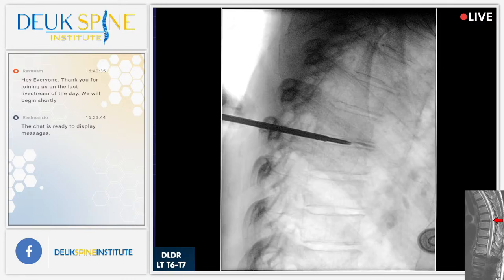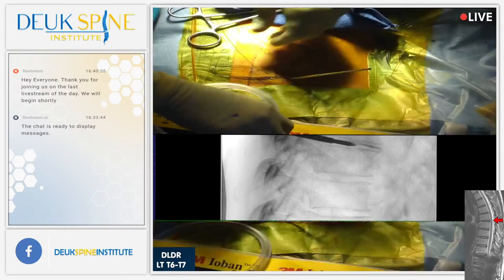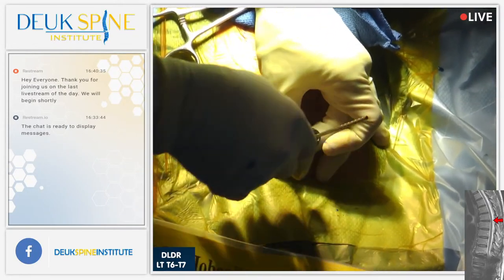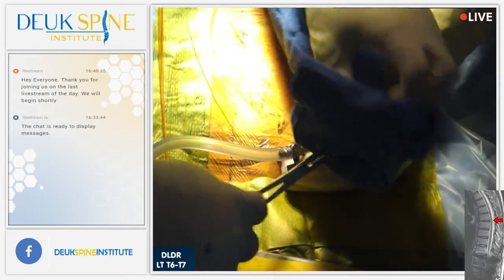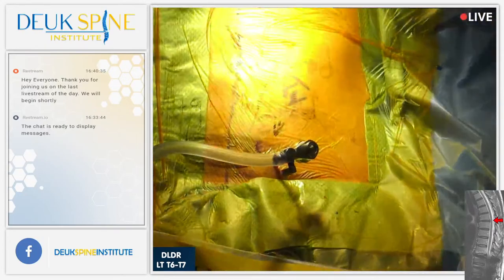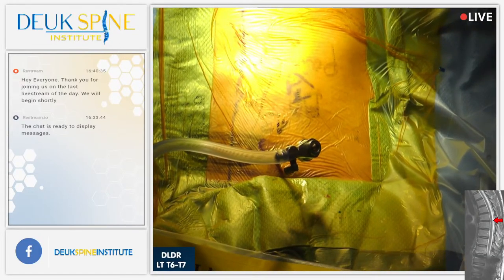Shot. All right, so you can see we're done. The tube retractor is inside the disc. Specifically, it's in the annular tear. And now we're going to remove the dilator. Shot. All right, you guys see that? So at this point, show them where the tube is.